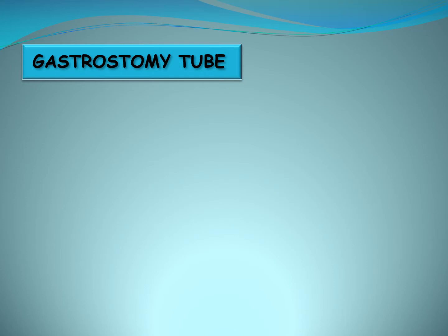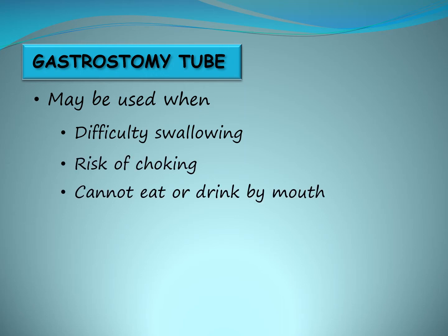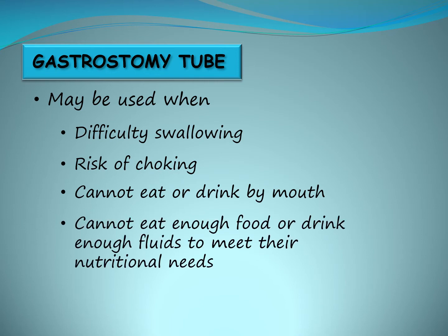A gastrostomy tube may be used when the child has difficulty swallowing, there is a risk of choking, the child cannot eat or drink by mouth, or the child cannot eat enough food or drink enough fluids by mouth to meet their nutritional needs.